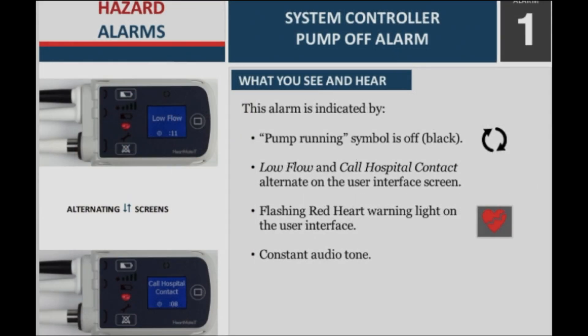System controller pump off — what you see and hear. This alarm is indicated by: the pump running symbol is off (black); low flow and call hospital contact alternate on the user interface screen; a flashing red heart warning light on the user interface; and a constant audio tone.